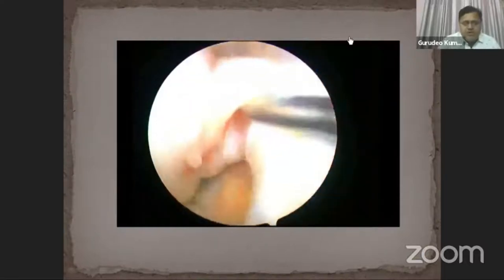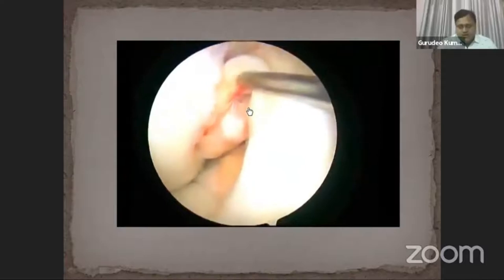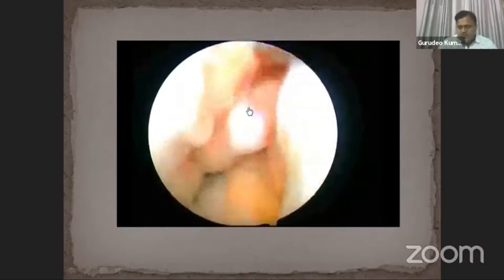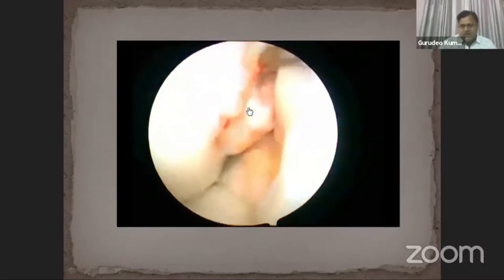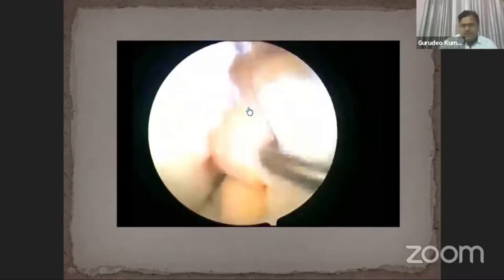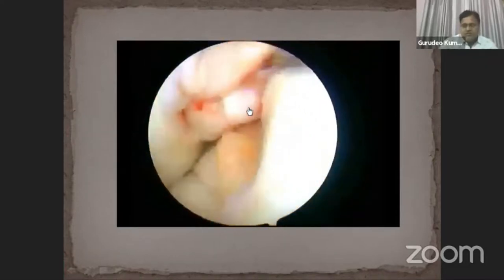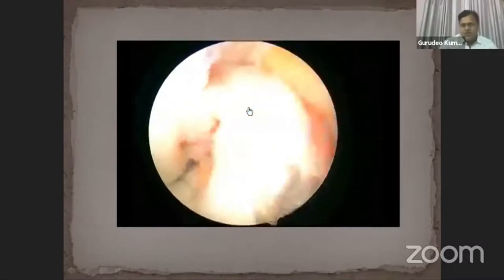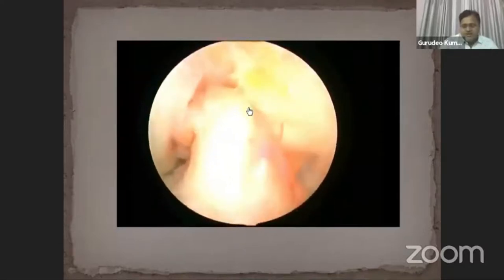Before doing the arthroscopic procedure, we put the arthroscope inside the knee joint. We can see here there is complete tear of the anterior cruciate ligament, both AM and PL bundle from the femoral side. And there is an entire remnant of ACL fiber which is bridging from femur to tibia. So the question definitely comes in mind whether to preserve it or resect it during ACL reconstruction.